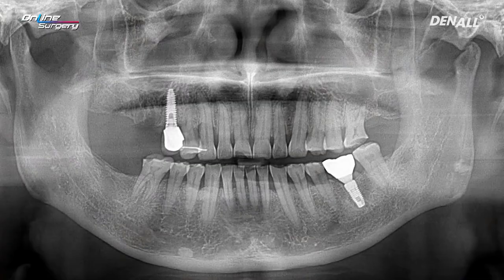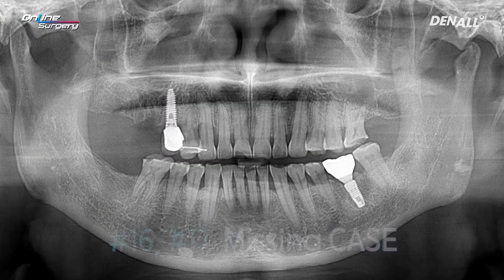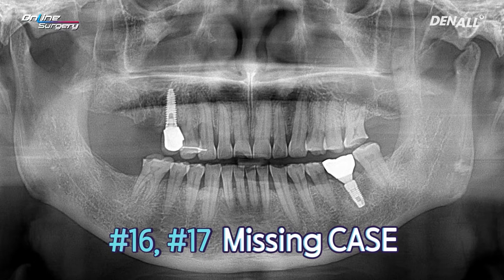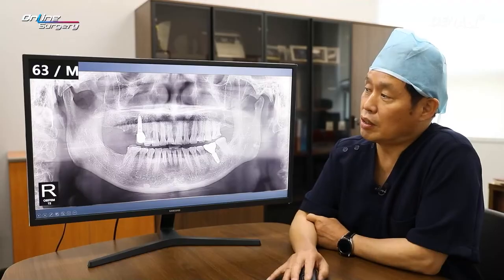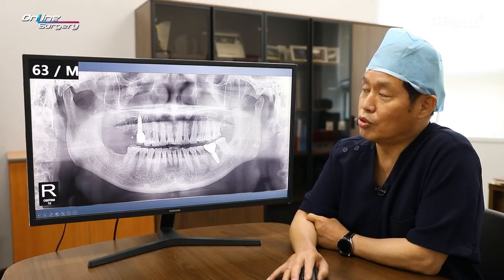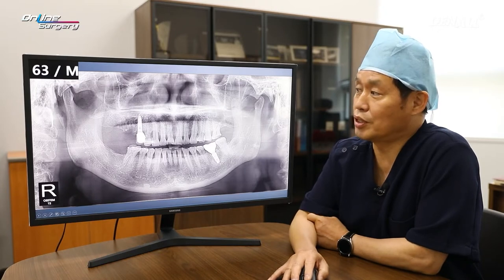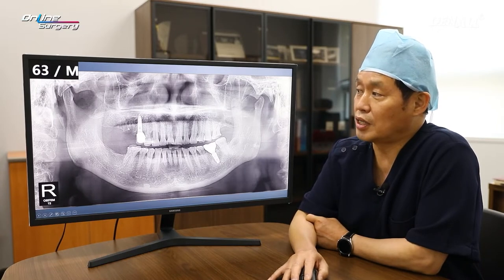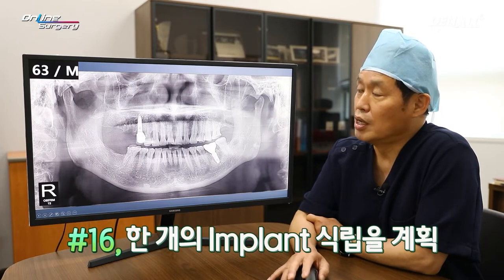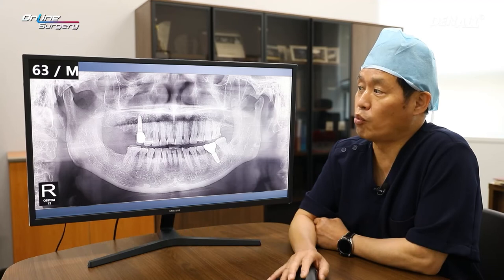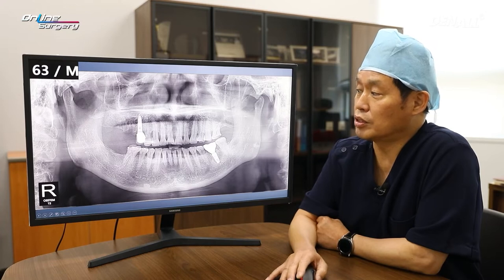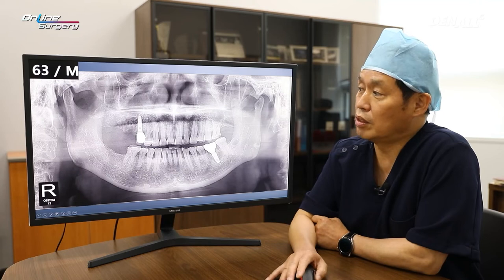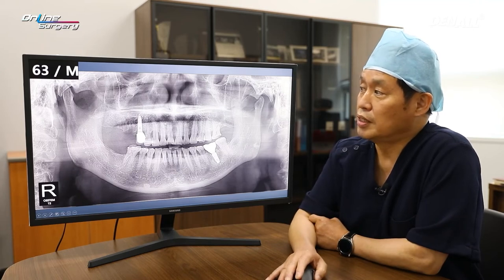63-year-old male patient. Upper 16 and 17 are missing. As you can see in the lower, the patient only has teeth up until number six. The patient did not really want two implants in the upper and just wanted one implant, so we decided to place just one implant in number 16. The patient does not have any systemic disease apart from a bit of hypertension, so there is no particular issue. Due to economic and other reasons, the patient just wanted one implant and that became our plan.